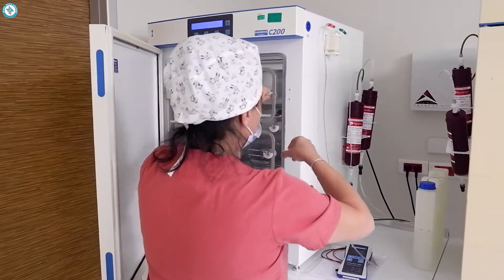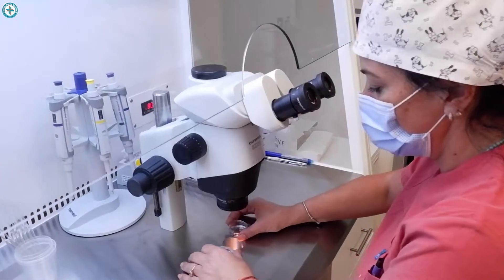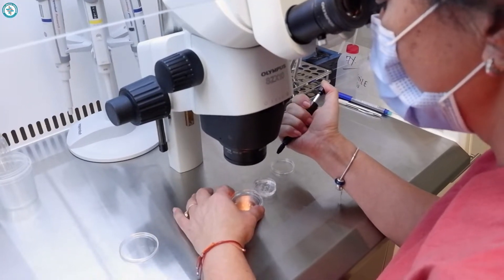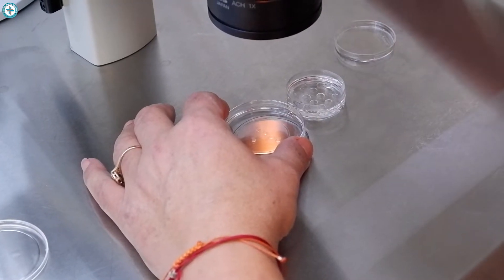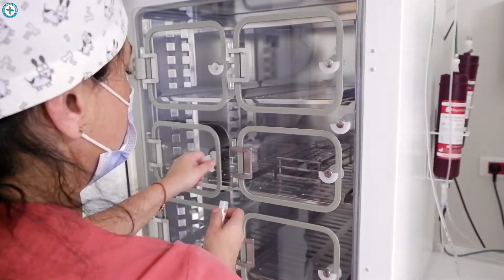For ICSI, the biologist takes the eggs from an incubator and places them in a lab dish. Next, she adds the sperm.